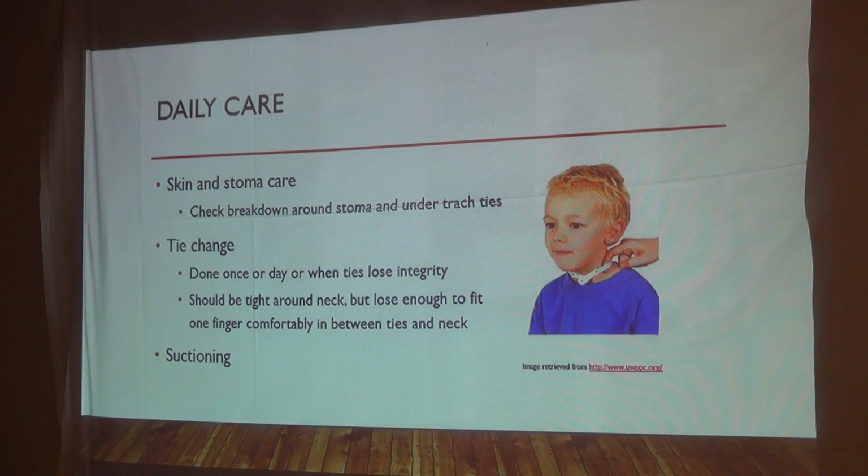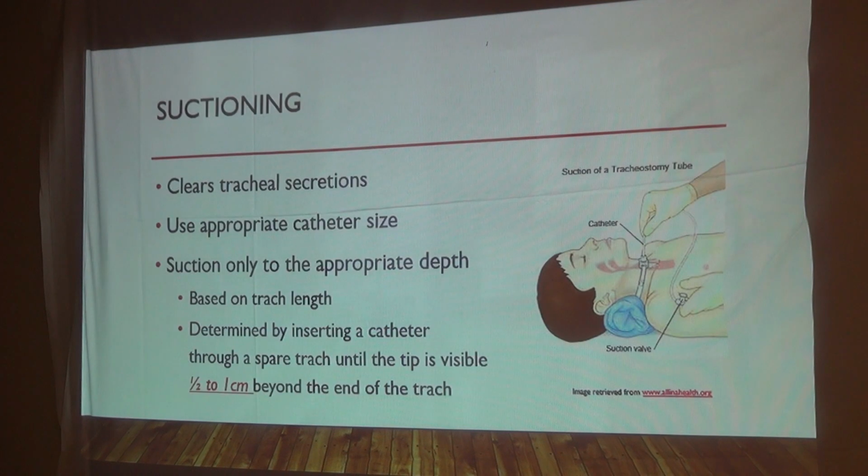But loose enough to fit one finger in between the ties. So as you can see in this picture, that's what's going on, which can be a lot of fun when you're teaching parents, where the dads have real big fingers and the moms can be like me with tiny fingers. So you work with them to figure out the exact tightness. And then suctioning, which will be our next slide.